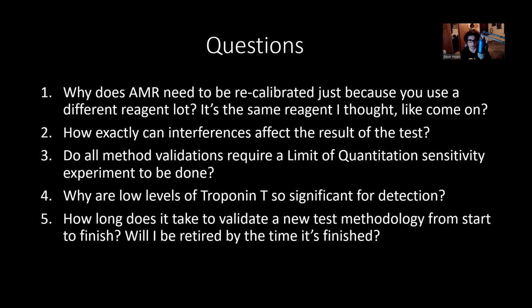Like I mentioned earlier, the more data you have is better. And despite CLIA and CAP requiring their minimum amounts, most institutions have their own prerequisites. They usually go for stricter standards than what the law requires of them.